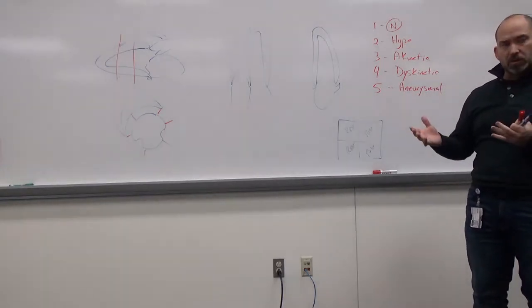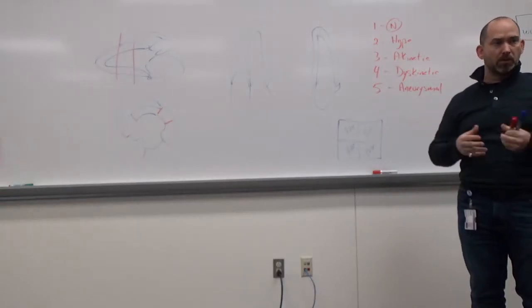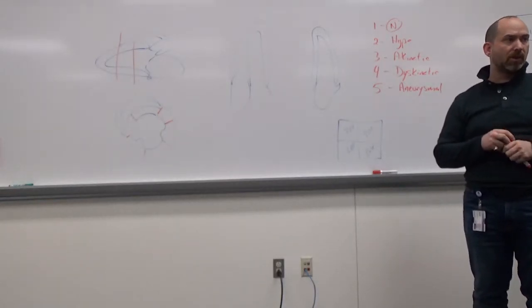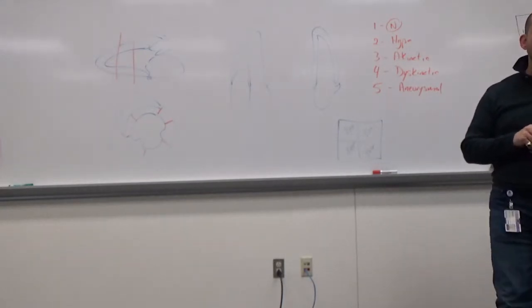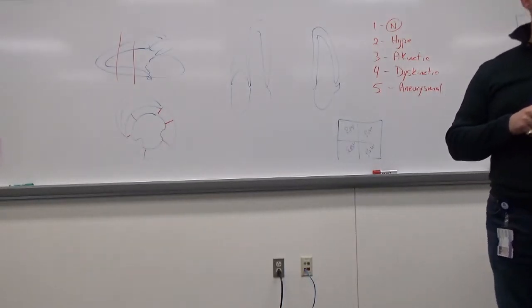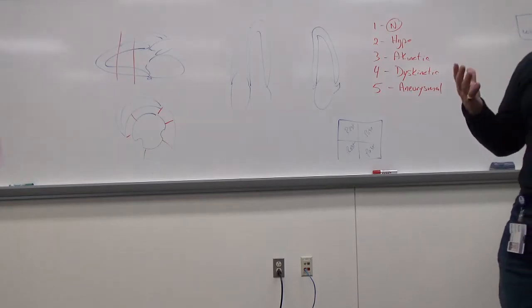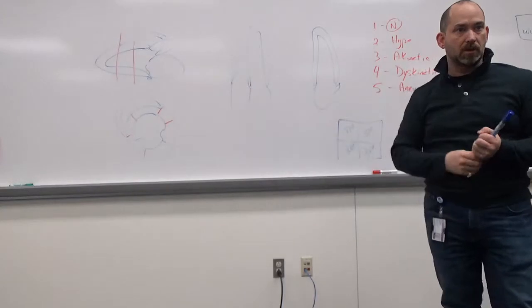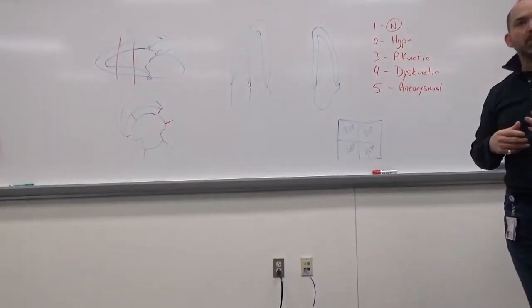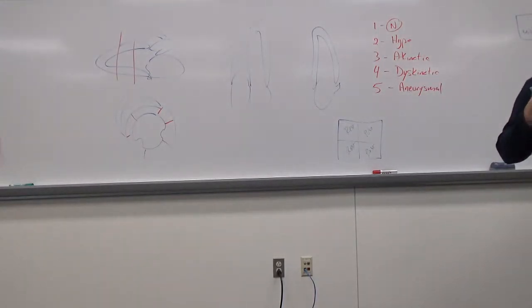The difference is, and it's very weird, when you have the opportunity, and most of my students have the opportunity to see stress exams, some of them have the opportunity to scan them. So it's pretty fun. If you're getting involved with scanning, you really want to know your wall segments. Okay, that's really, really important. But you're going to have patients that feel very awkward when they're laying on their bed. They're not used to exercising.